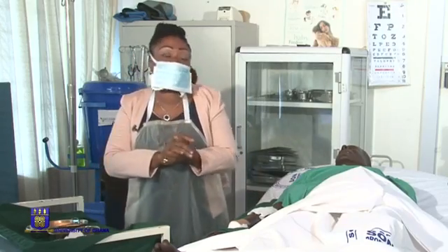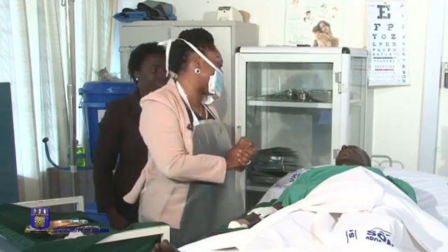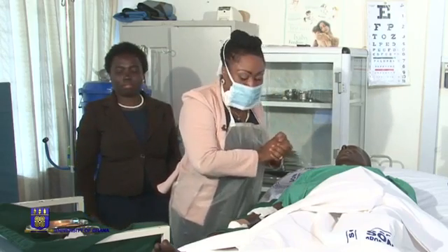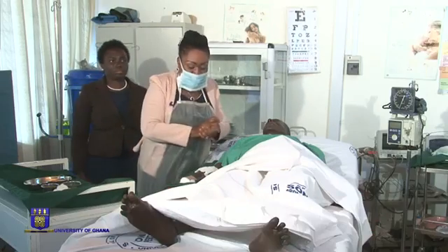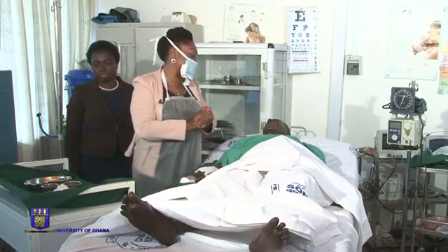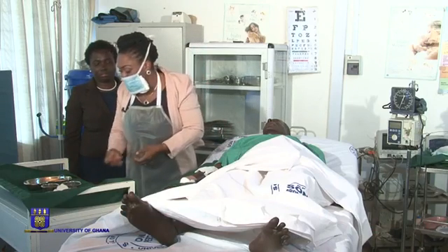So it's now time for the wound dressing. Mr. Say, I came to talk with you a few minutes ago that I was going to prepare and come and dress your wound for you. I am now ready, so I have brought my things and I'm about to start with the procedure.